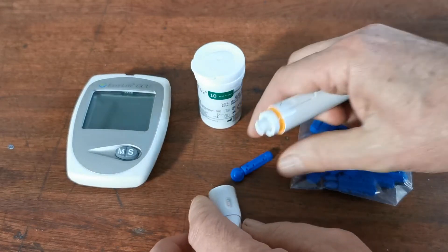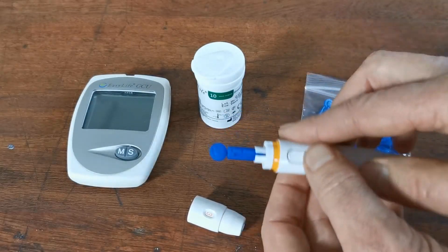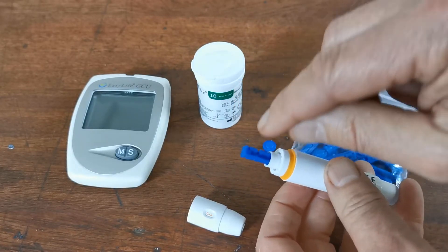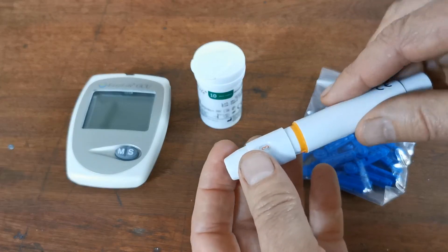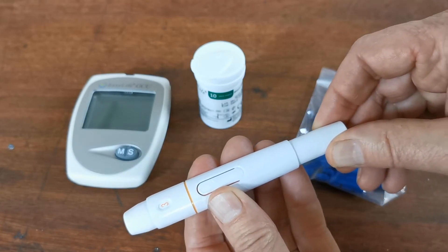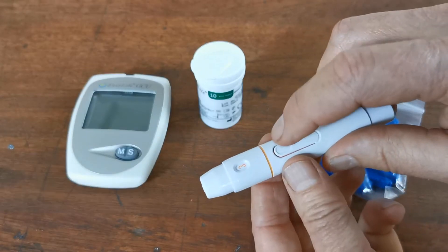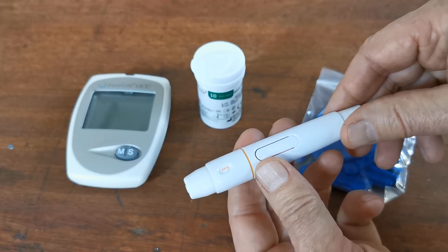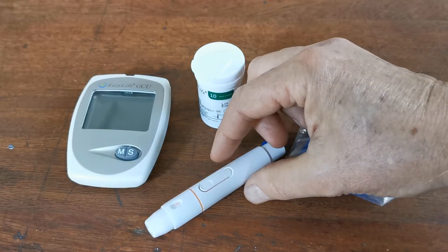Rotate and pull the lancing device apart, then insert one of the lancets. Push it firmly down in, then with a rotating action remove the cover from the lancet — the sterile tip is now exposed. Reconnect the lancing device, rotate it and lock it. To trigger it, pull back on the end of the lancing device; the release mechanism is the trigger in the center. You'll hear it trigger, and you can reset it just by pulling back. With that, you are ready to do your finger lance.